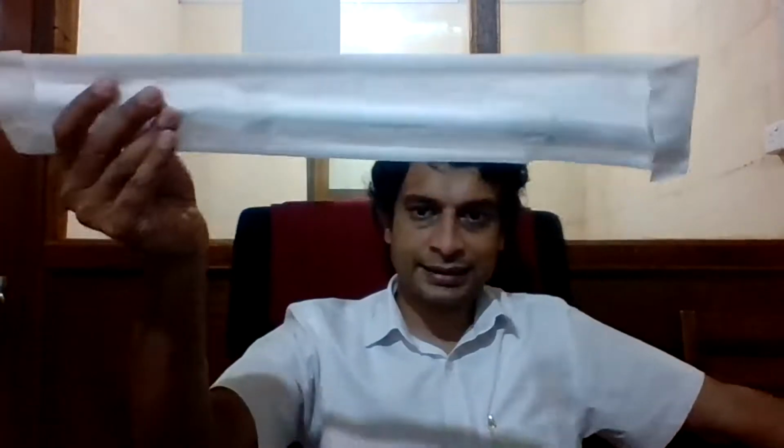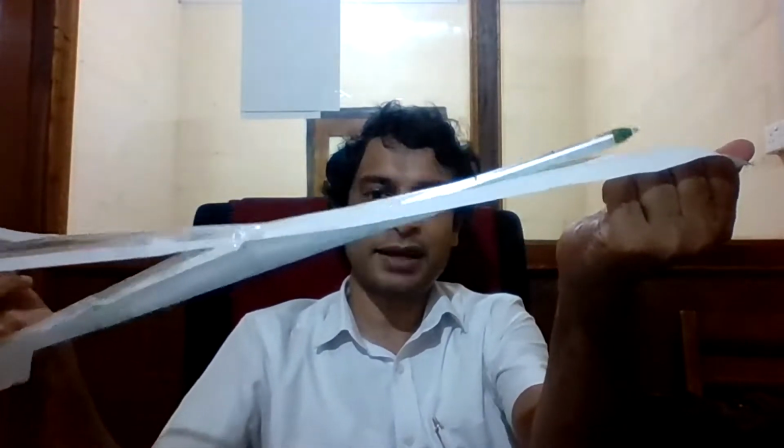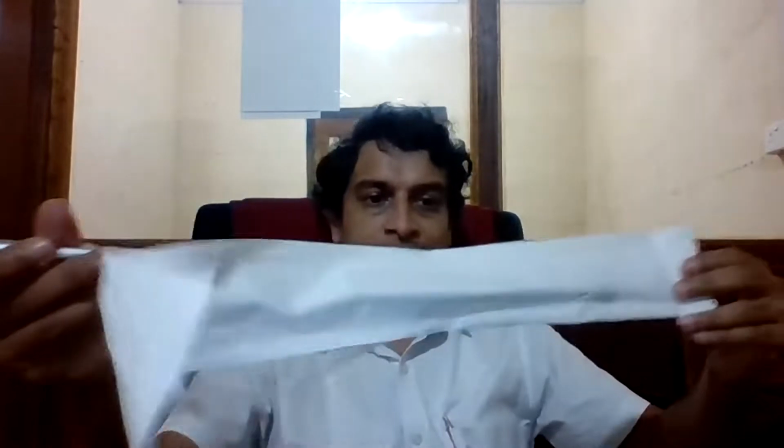So now I'm going to break sterility and take this out. Now this is the inner pack. In case you have broken sterility, the inner pack also has the same system where you have to do that. So one of the first things that you will have to learn in the ward is, when someone is doing a sterile procedure and they want a needle or a syringe, how to open the tube like this and give it. So this is the way that you open it in a sterile manner. Haven't touched the inside at all, and you can offer it to them like that and they will pick it up. Here I'm going to pick it up and take it out.